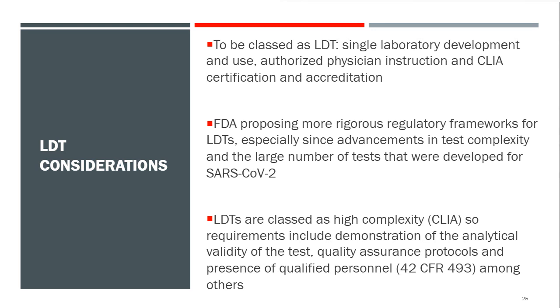So the FDA is proposing much more rigorous regulatory frameworks for lab-developed tests, especially as tests have become more complex, and a large number of tests that were developed for SARS-CoV-2 as well, and how in-house methods, lab-developed tests, and they're getting a little concerned on how those are being handled and measured.